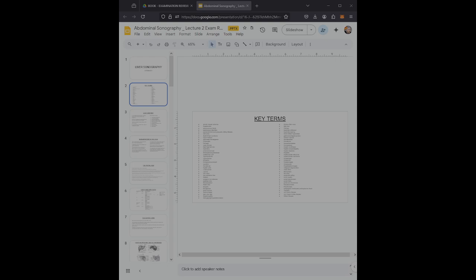We had already looked at splenomegaly with hepatosplenomegaly, but splenomegaly is the enlargement of the spleen. The starry sky sign is a sonographic sign associated with the appearance of periportal cuffing. And with this periportal cuffing, there's increased echogenicity of the walls of the portal triads. And this presents as a starry sky sign. Steatohepatitis is a type of fatty liver disease that causes inflammation of the liver. Total parenteral hyperalimentation is a procedure in which an individual receives vitamins and nutrients through a vein, and oftentimes they use the subclavian vein.